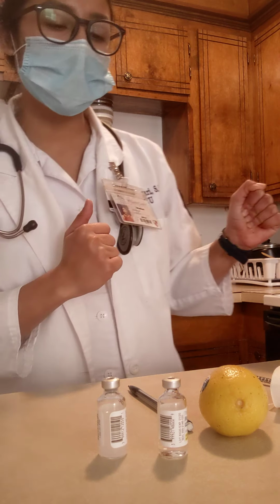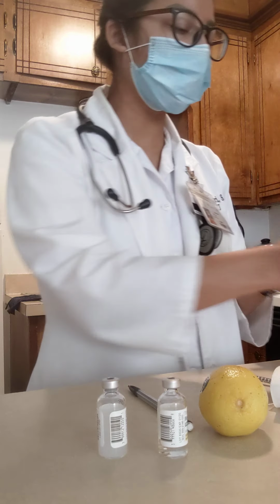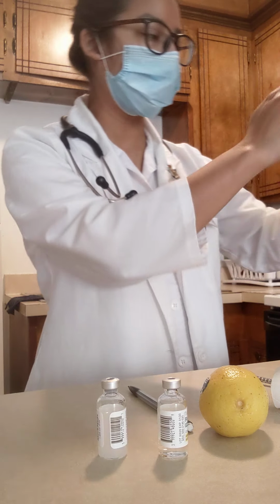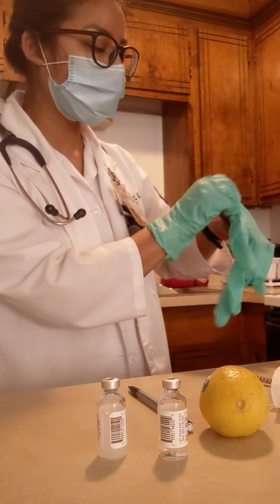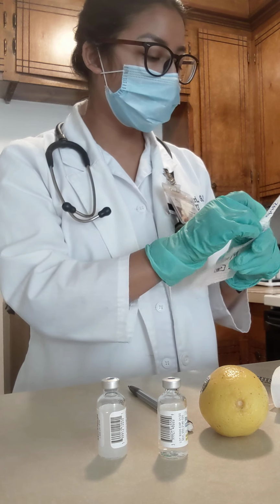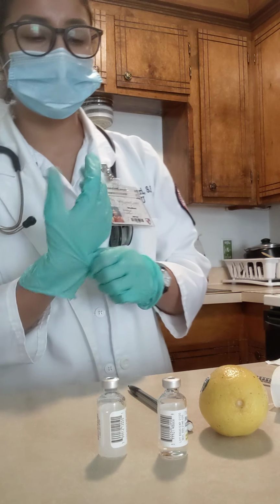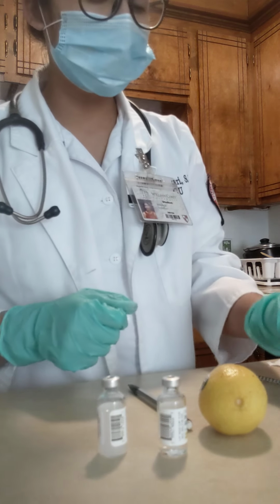Since this is my correct patient, I'm going to do hand hygiene and put on some clean gloves. I'm going to ask my patient to wash their hands and dry their hands completely. While my patient does that, I'm going to turn on my blood glucose meter and place a strip on the meter.